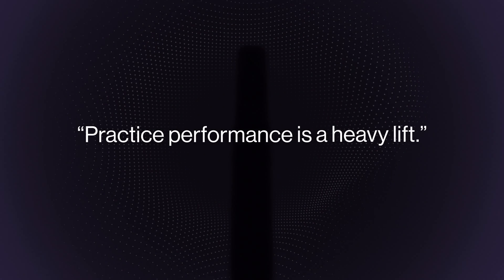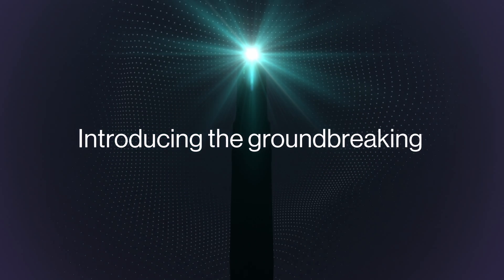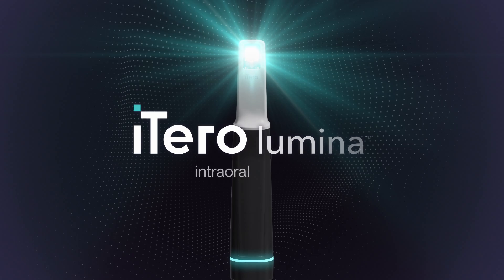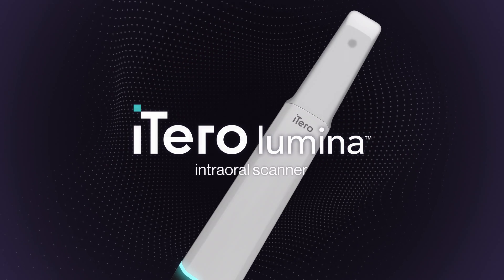Practice performance is a heavy lift. Think again. With the groundbreaking new iTero Lumina intraoral scanner, it's time to rethink what a scanner can do for your practice.